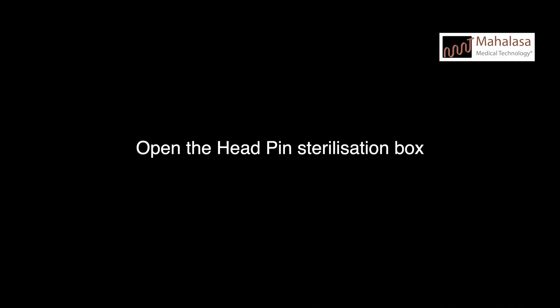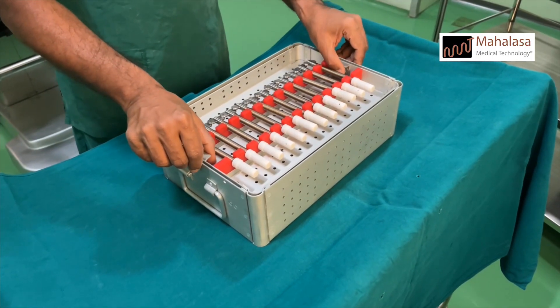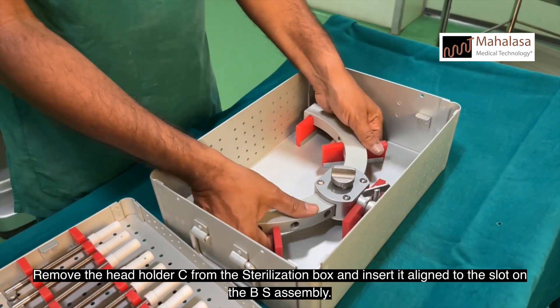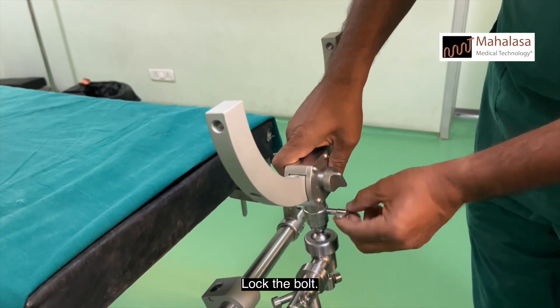Open the head pin sterilization box. Remove the head holder C from the sterilization box and insert it aligned to the slot on the BS assembly. Lock the bolt.